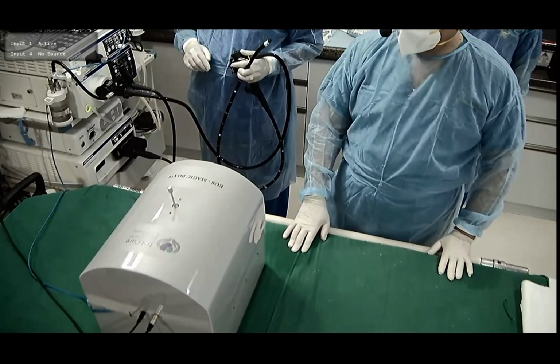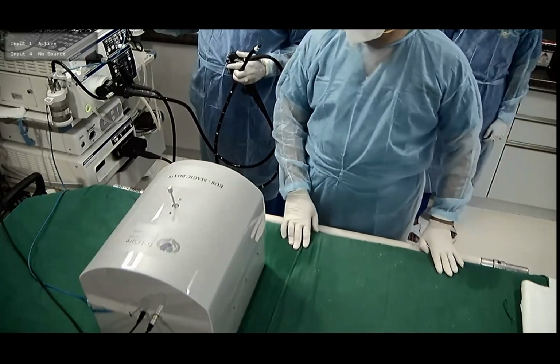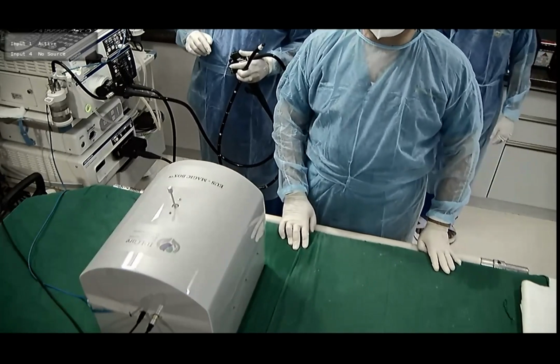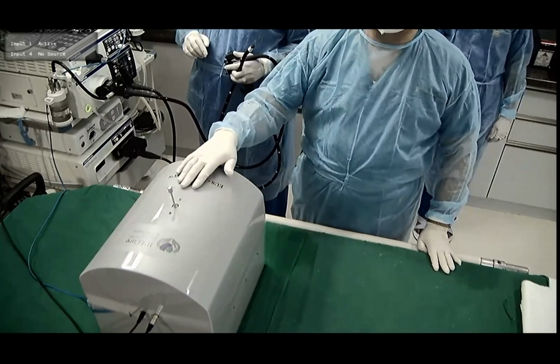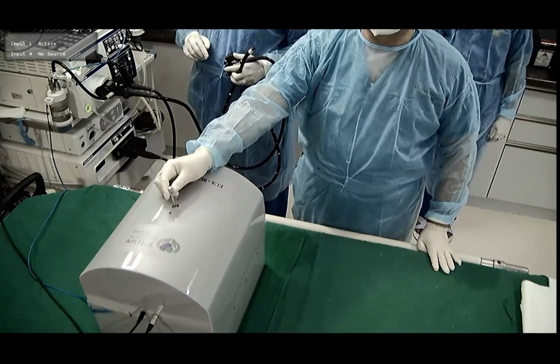What this magic box is, basically, it's a box, and to avoid fluoro in all cases, we have put a camera at the top here. You can see this is a toggle by which we can move the camera. Can they see this?